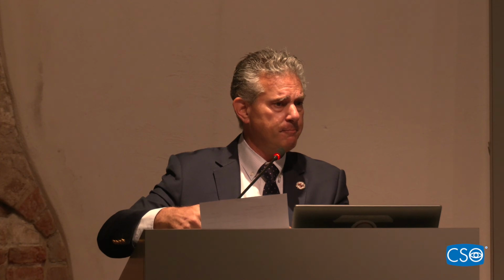Like I said, I have 5, 4 in my testing rooms and 1 on my desk. So I have a slit lamp and my own MS39, which is my slit lamp of the 21st century, because if I want to look at cross-sectional imaging, I can do it immediately. If I want to look at difference maps, I can do it immediately. I don't have to send the patient out and bring them back in. So congratulations to CSO on this device and Francesco and his team.